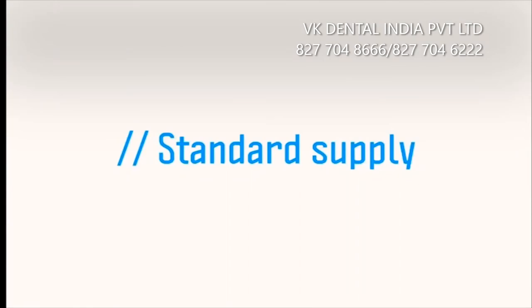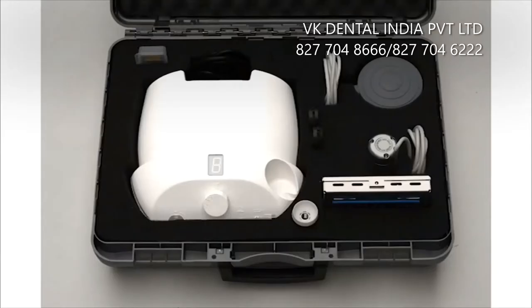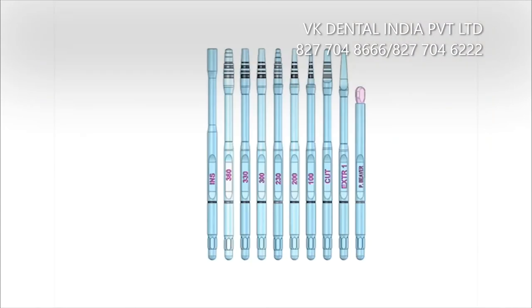In the specific Magnetic Mallet kit, you'll find the power supply, the osteotome function handpiece, the foot control, and a 10 instrument kit containing 10 different osteotomes.